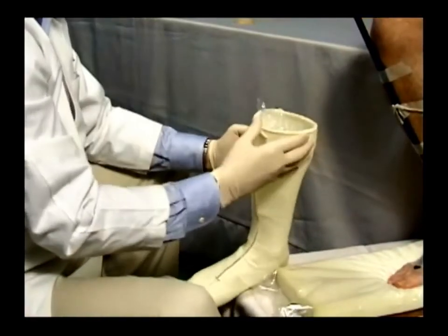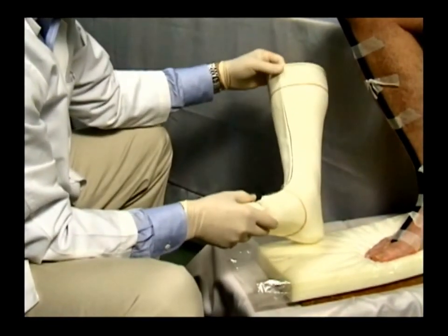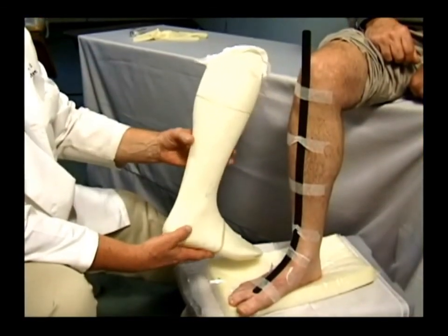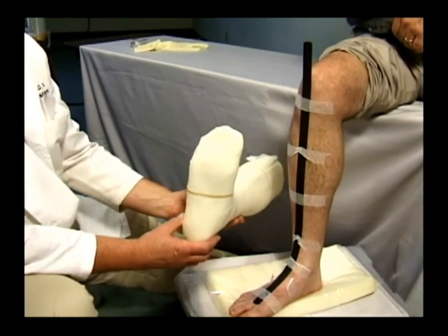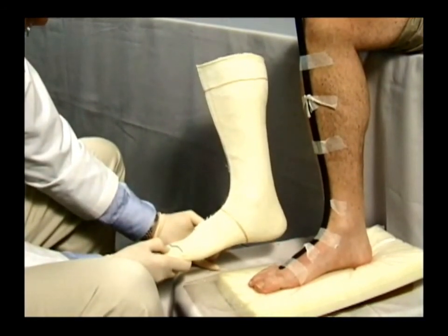Rubber bands are used to hold the cut margins together after they are aligned. Gently stuff the opening with newspaper. The mold is now ready for immediate shipping. Finished molds made from the STS sock material can be used as a positive or a negative mold. The glass smooth uniform thickness of the surface material is ideal for scanning purposes. Unlike plaster, the mold can be reused over and over again. The molds are also durable, yet very lightweight for shipping. The finished mold replicates the shape of the patient's foot, ankle and leg extremely well. There is no messy cleanup on the patient, furniture, floor or clothing. Thus, this process can be done anywhere outside of the office or clinic setting.